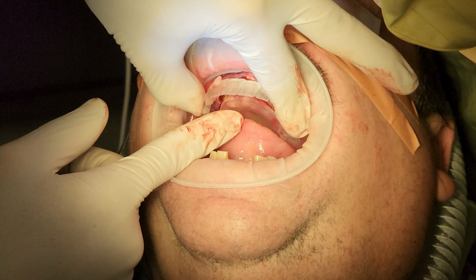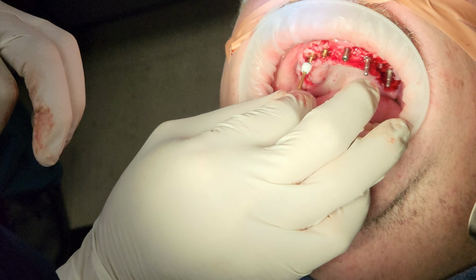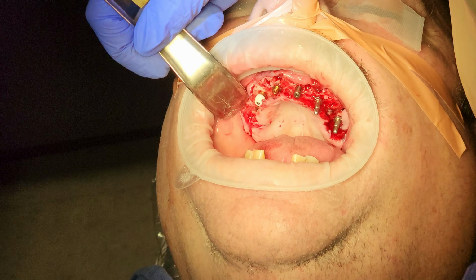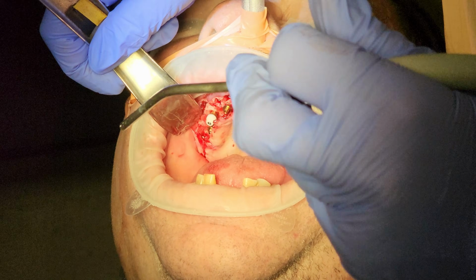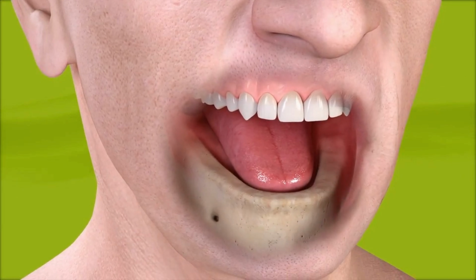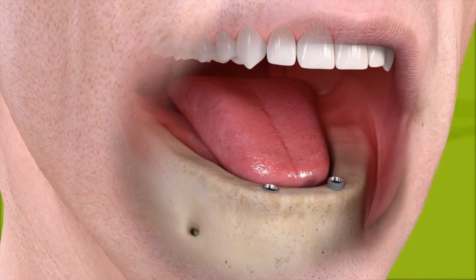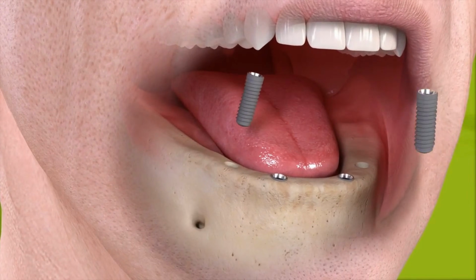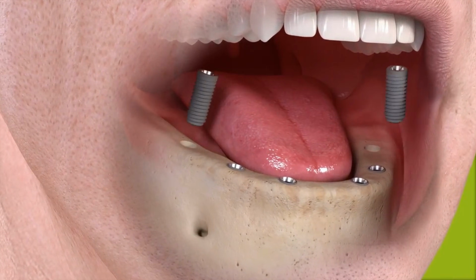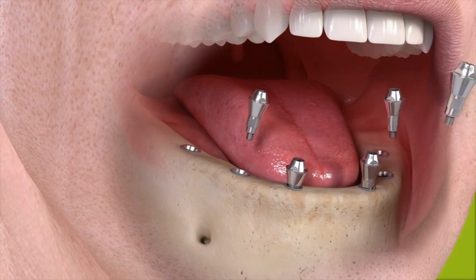And when we're putting these in, our devices measure that that's about how much tightness we're getting out of each implant that we put in. And if we're not getting that solid stability, we have to find a new solid spot of bone for the implants until all of the implants firmly attach into place. Now, as I said, each implant has threads on the outside that hold it into the bone, but they also have a hole on the interior with threads as well that will accept a screw. In other words, it's the female part of the screw complex.